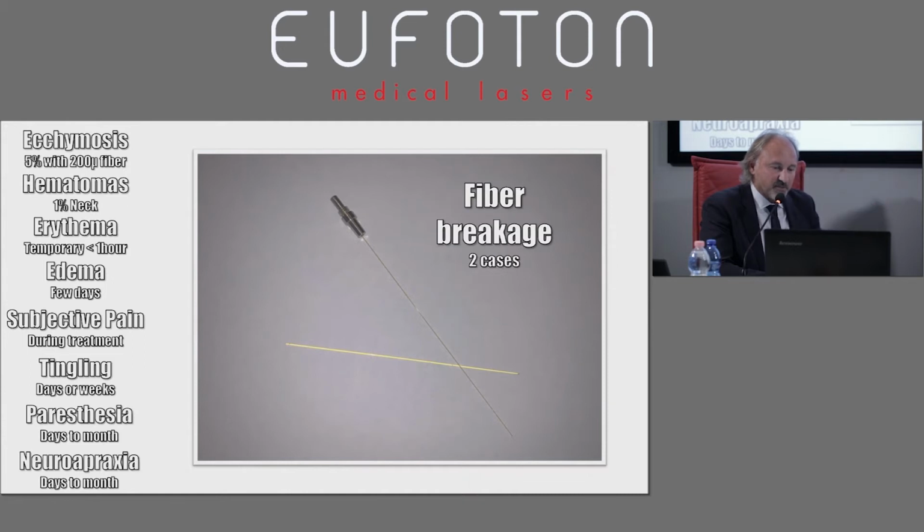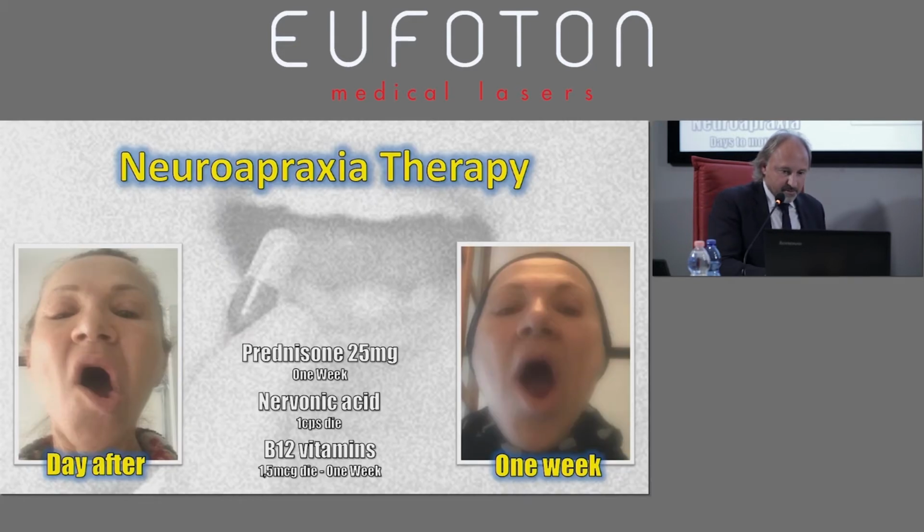the energy delivery will matter for the good result. High energy, high watts, is like burning food with a flame, and low watts is like cooking something at a low heat. So we're not interested in carbonization, no way to use high powers. And then two new concepts, coagulation and vaporization. These lasers want to get coagulation and not vaporization. So a more constant, slow, prolonged energy delivery is more effective than just flames or quick blazes of fire.